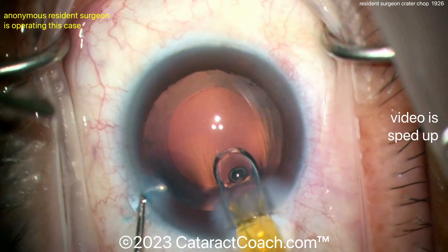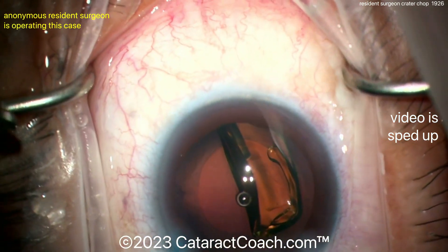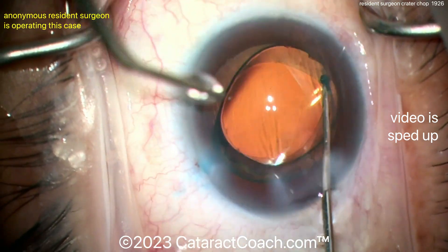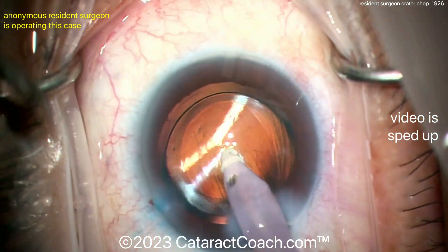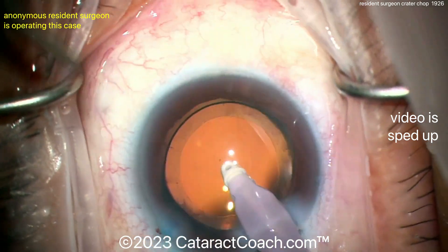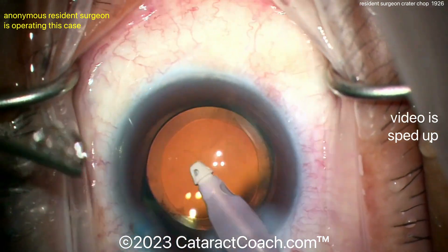If you're having a hard time with the time constraint: with normal horizontal chop, you buzz in with the nucleus with the phaco probe, hold the nucleus with high vacuum, then get the chopper and chop — all within a second or two or three. If you have trouble with that, try crater chop. By making that central crater, you just put the phaco probe in that crater for countertraction; you don't need any phaco holding power and you don't even need to use your foot on the pedal other than to infuse the eye in position one.